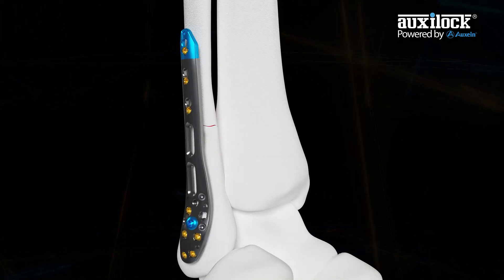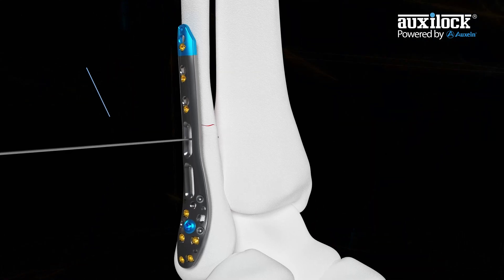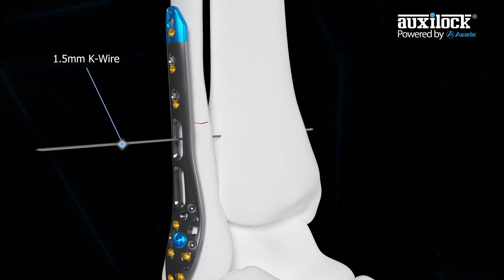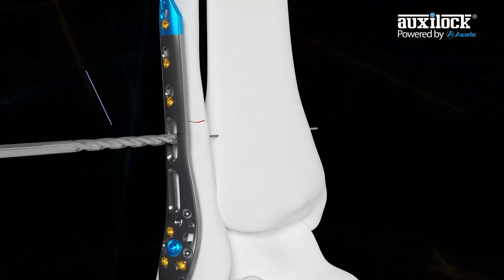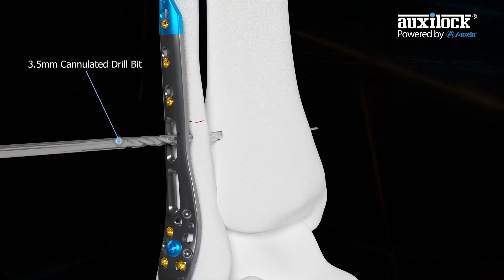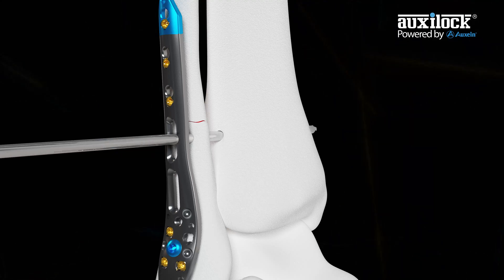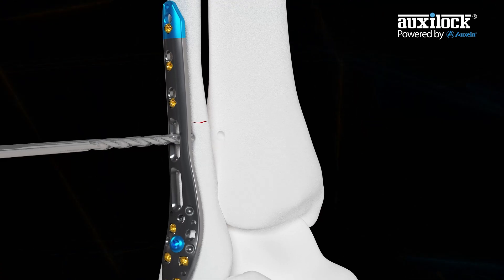If using a fracture plate, use the preferred technique to attach it. Use a drill guide to drill a 1.5 mm K-wire from lateral to medial through a hole in the fracture plate and all four cortices of the tibia and fibula at the preferred angle. Use a 3.5 mm cannulated drill bit to drill over the K-wire from lateral to medial through all four cortices. Remove the K-wire and drill bit.